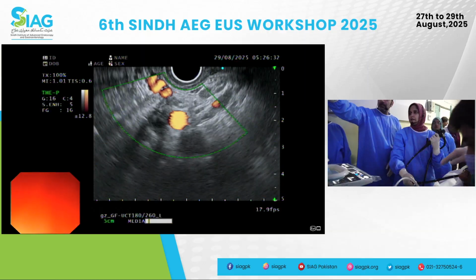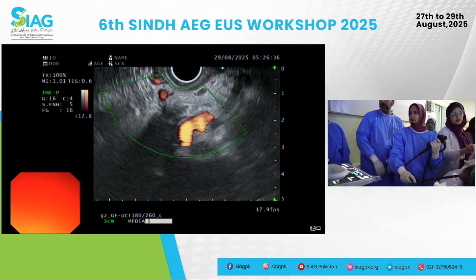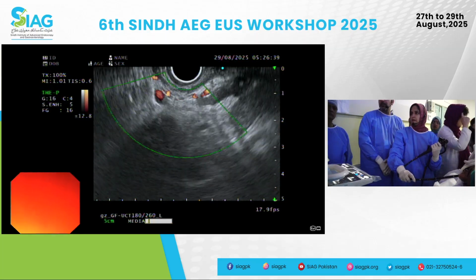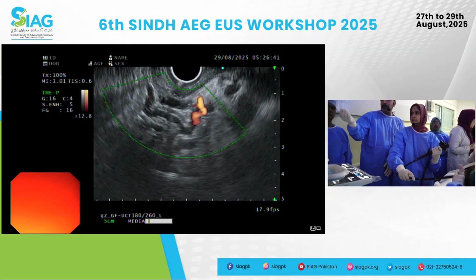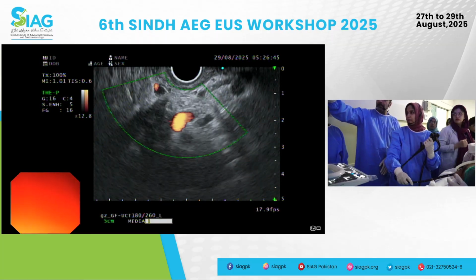So now when it goes down, you have to slightly move the big wheel towards you, and keep going big wheel towards you to keep it in view, and keep going clockwise. Right about there you lose it. So you bring up a good point about potentially there being collaterals.